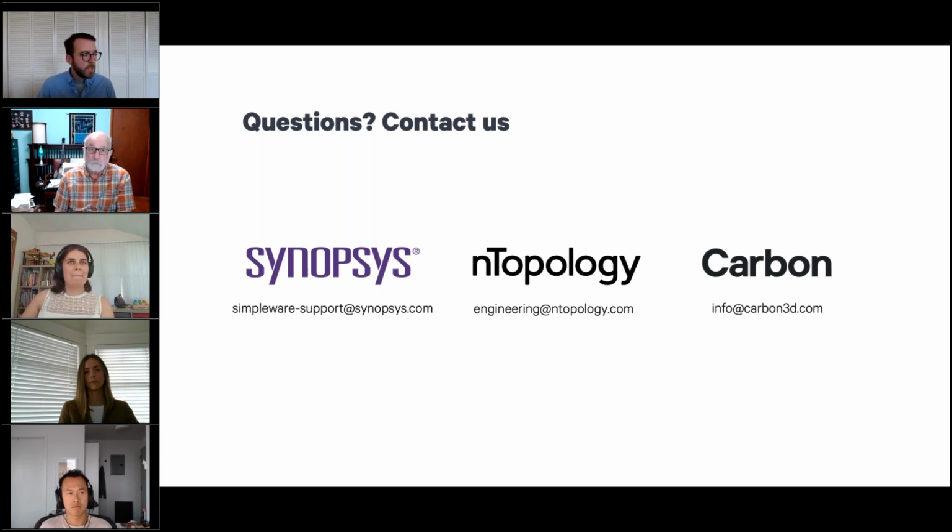Great. And we have one for Christopher as well. Looking at the workflow that you've built in nTop and demonstrated here, how much of that would apply to a different bone or surgery entirely? If you have a library of base cutting guides, can you drop them easily into other processes and other bones?